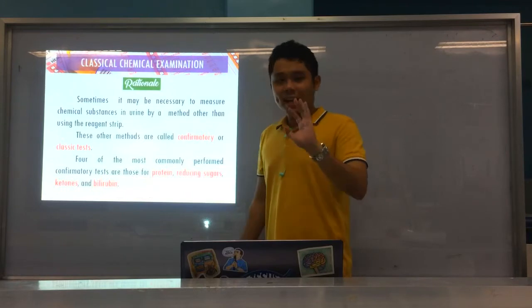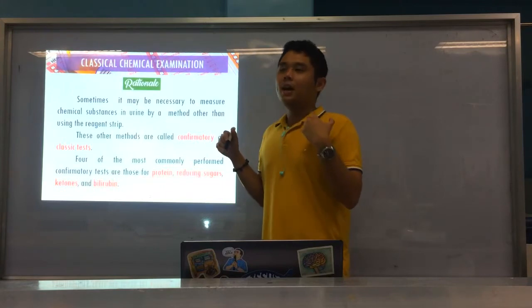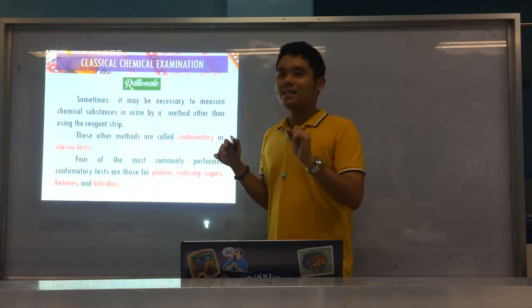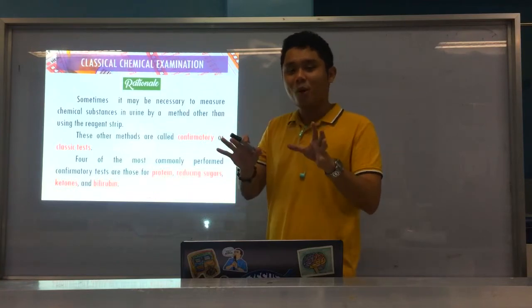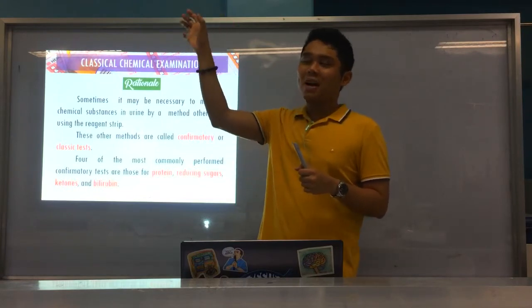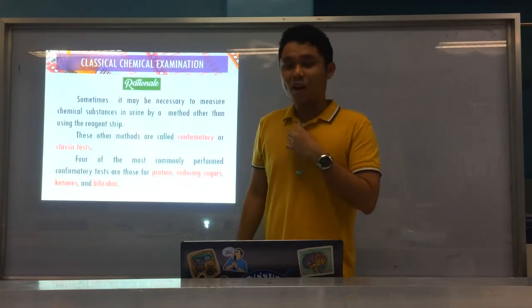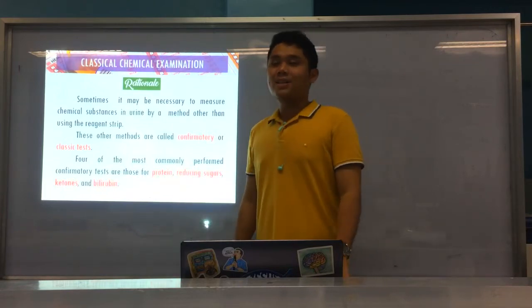Okay? Alright. But again, each of your chemical analytes in urine, for example, bilirubin, urobilinogen, nitrite, and porphobilinogen, and so on, have many classical tests in your lecture with Ma'am Bernal. So, there's one table, then many tables, and then the substance, and then which reagents will be used, and then what the positive results are. So, as in, it's really too much information. Anyway, alright. But for this lab, what we're gonna discuss is only protein and glucose as classical exam tests.